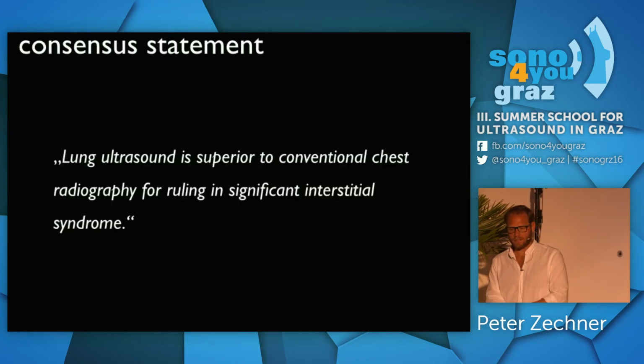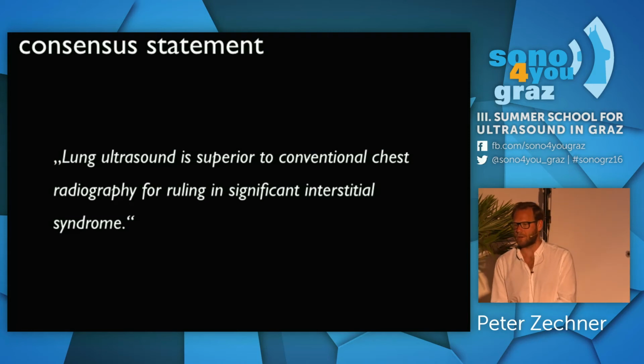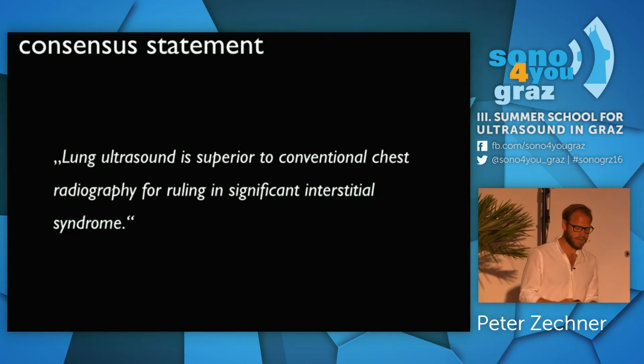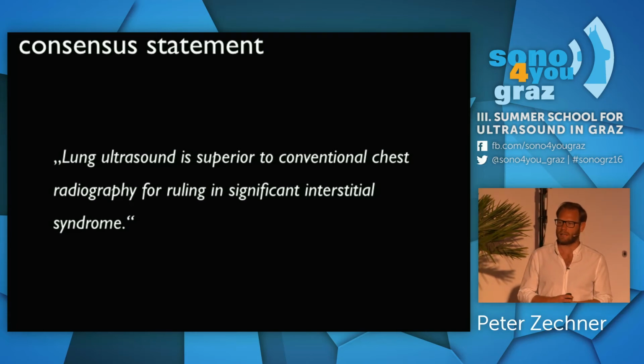Okay, also here, the consensus statements tell us that ultrasound is way better than conventional chest X-ray to include and exclude pulmonary edema. So we know that we are better using ultrasound than chest X-ray, auscultation, or any other clinical findings.